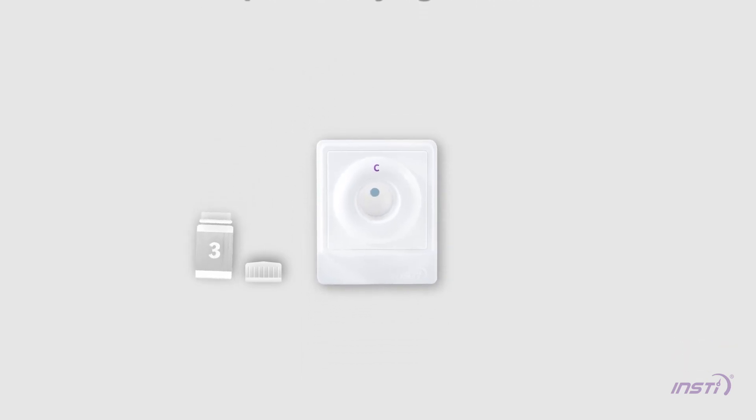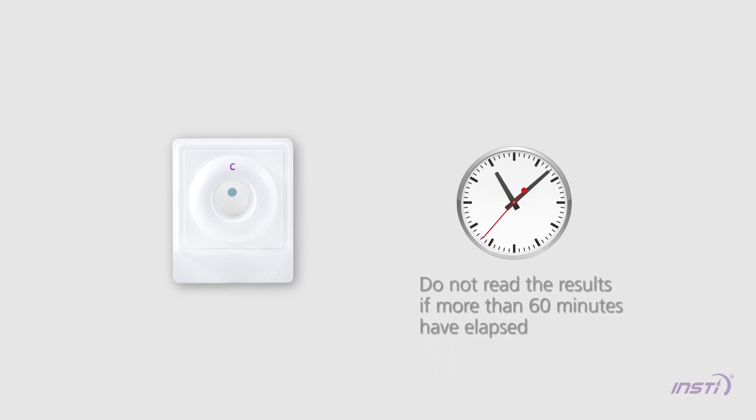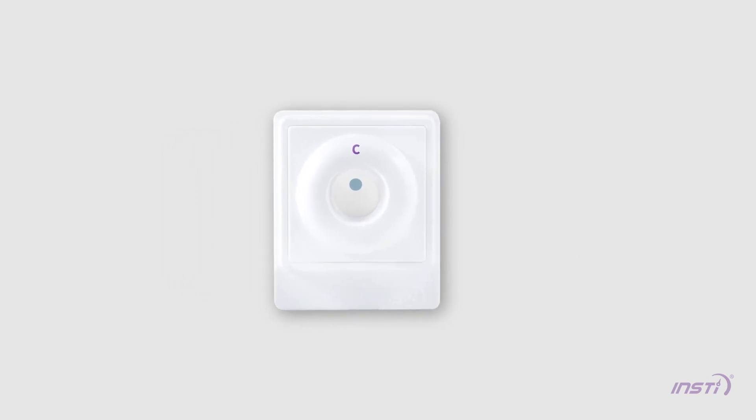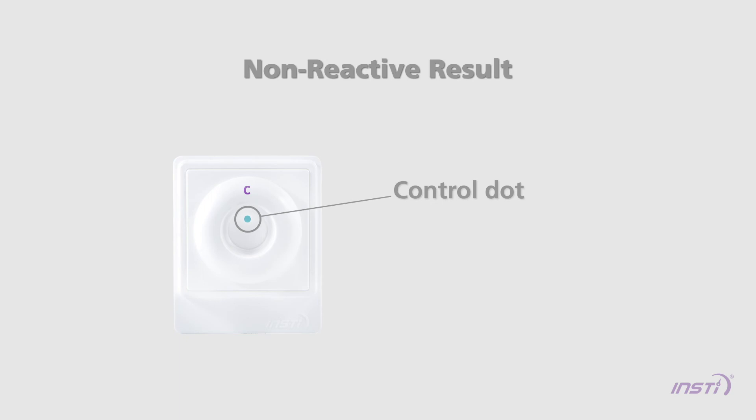Read the results immediately while the membrane is still wet. Do not read the results if more than 60 minutes have elapsed following the addition of Bottle 3 solution. When reading the results, make sure the tab of the membrane unit is oriented towards you. Non-reactive result: one blue control dot that is clearly discernible above any background tint should appear on the membrane. The control dot indicates the test has been performed correctly and a human specimen has been used.